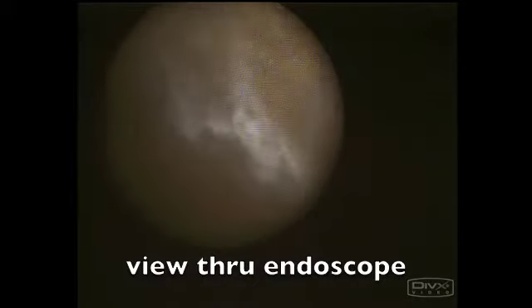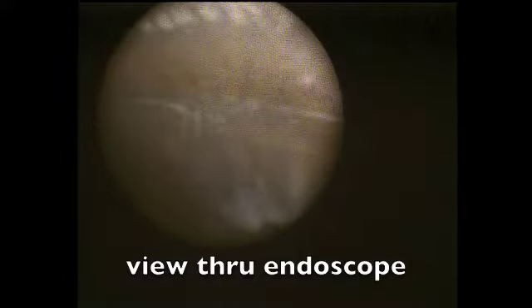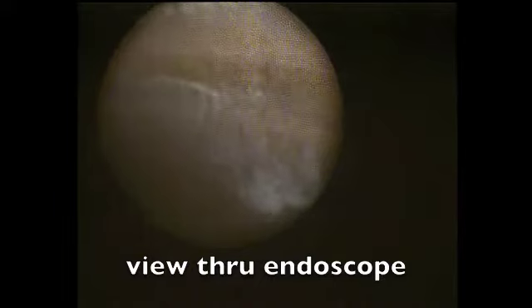This is the peripheral cut edge of the vitreous. This is the pars plana region. You can see the ciliary processes here. This is the posterior fundus, optic nerve, and the macular area. This is the view with the 20 gauge endoscope.